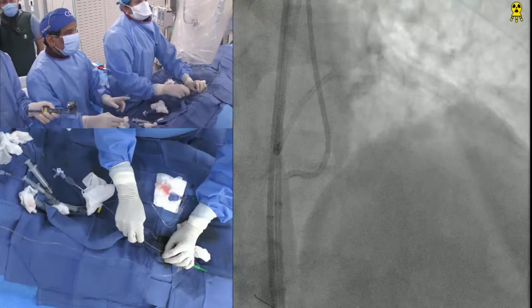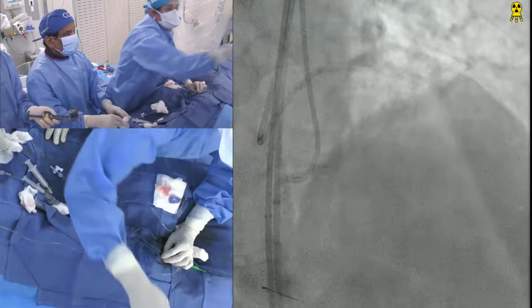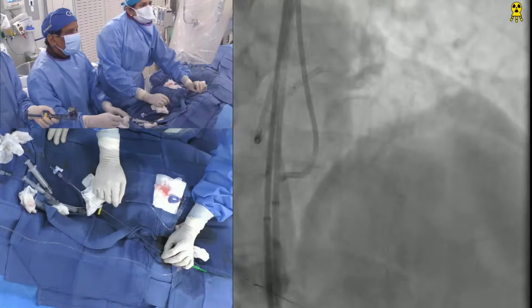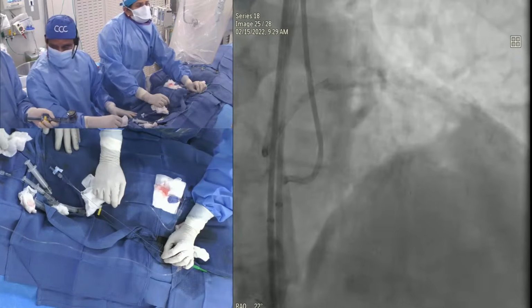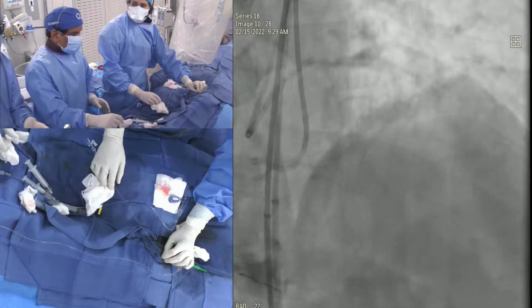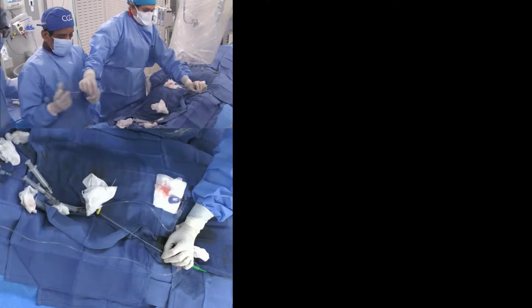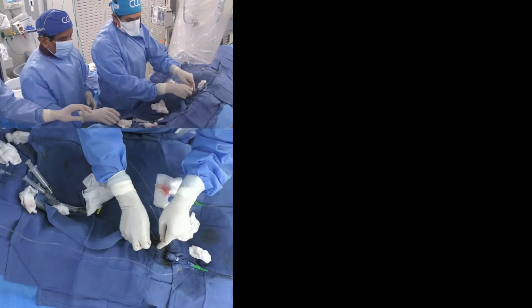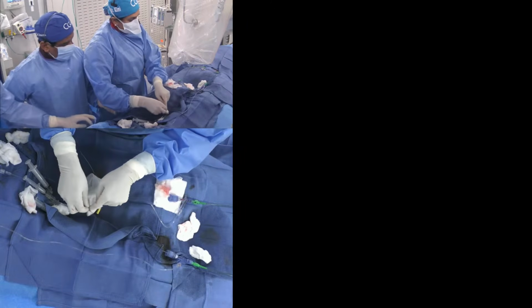So this is the 2.0. You want 1.5 or is it different? This is a 2.0 balloon. My question is, do we dilate the stent strut there? Okay, we can dilate, a little POT type situation. That's okay. I don't think it's a balloon issue. It's the ostium. We need to get 1.5. No, means a strut. So you have an 8 millimeter balloon, 2.0 by 8. Okay. So clearly there's no question that no matter how we do, anytime you go to the side branch is a trouble.